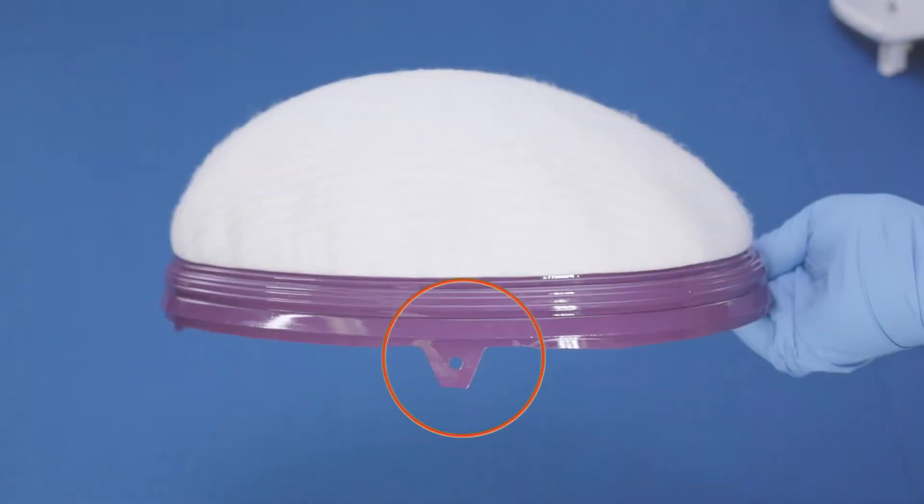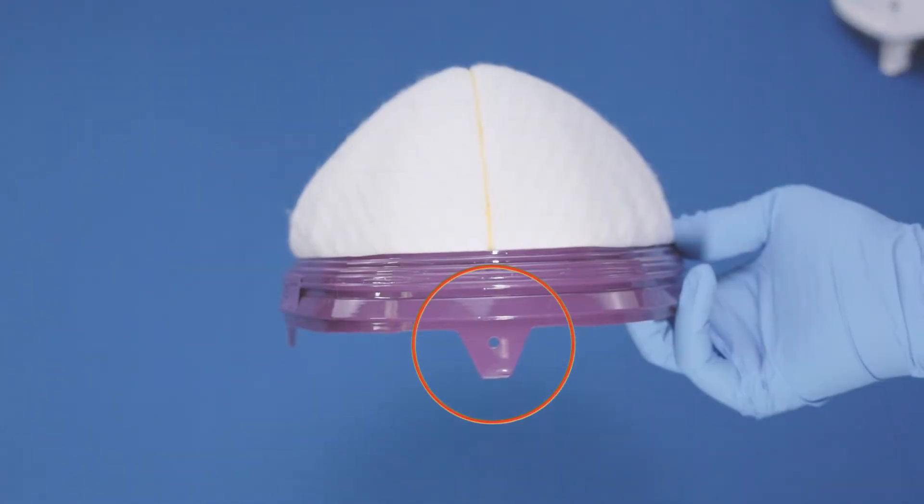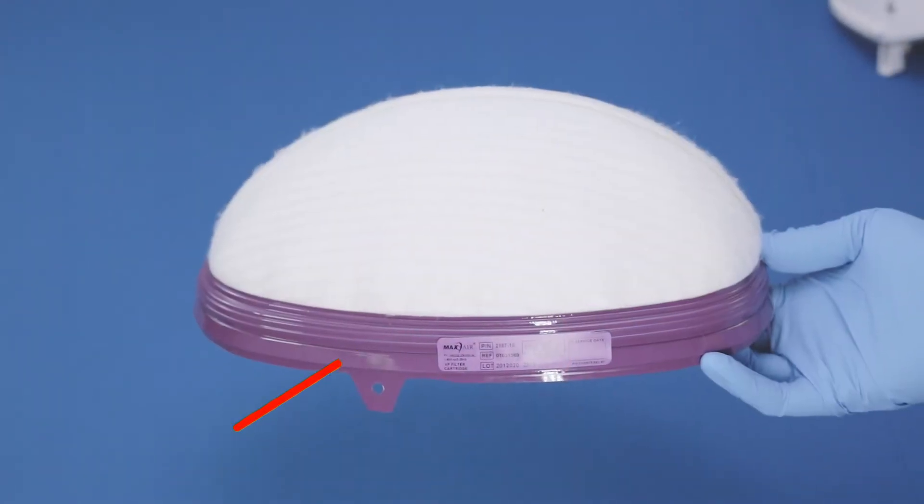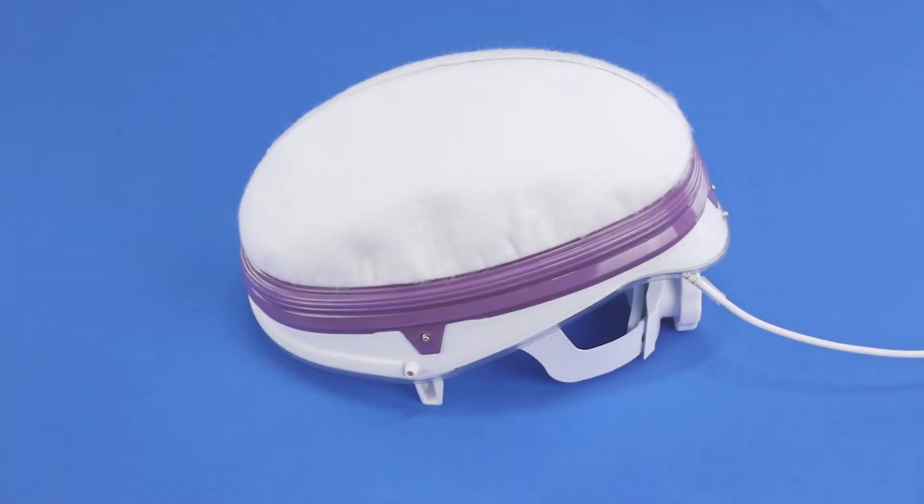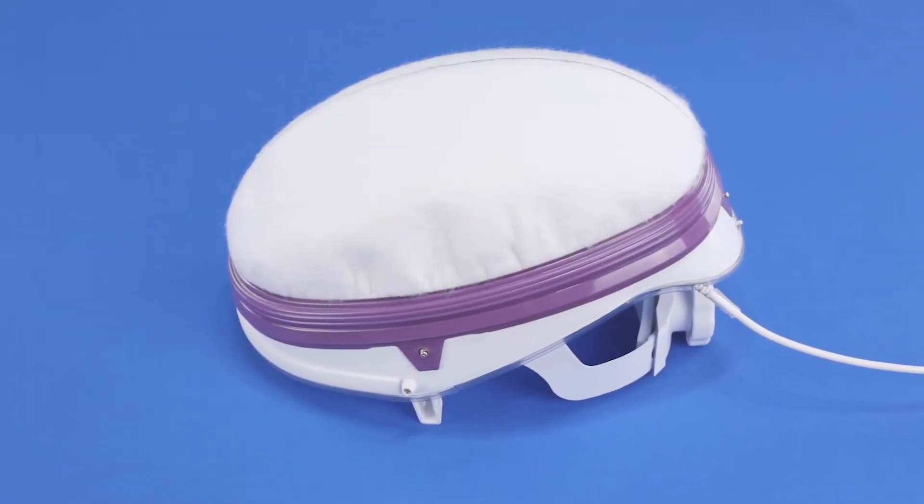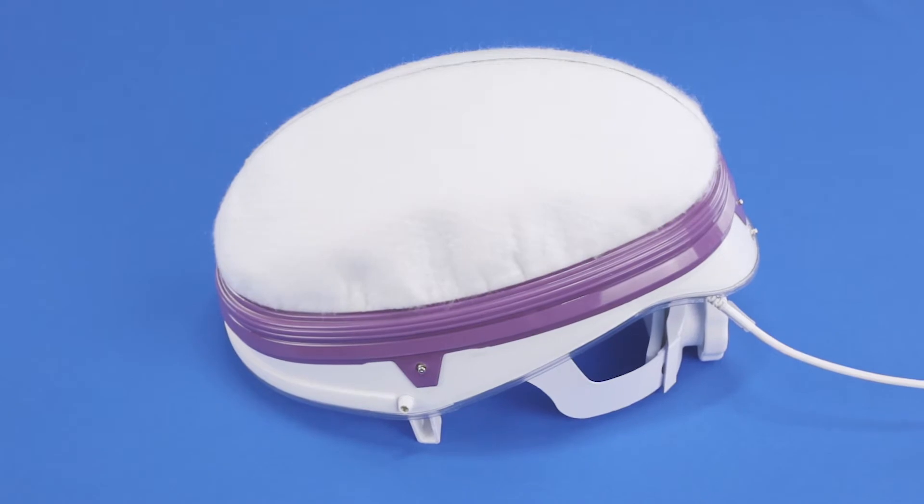Key components of filter cartridges include right and left side snap tabs, rear snap tab, and magenta retainer ring. All MaxAir filter cartridges assemble and disassemble in the same manner as the example shown in this video.